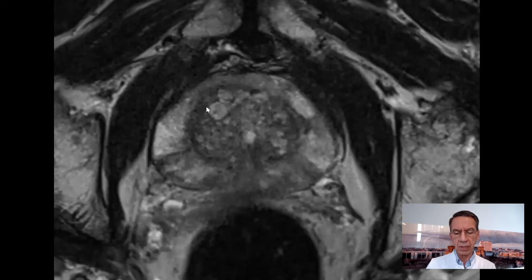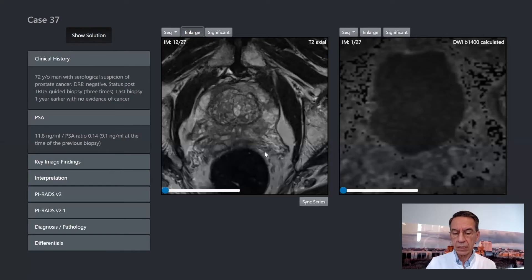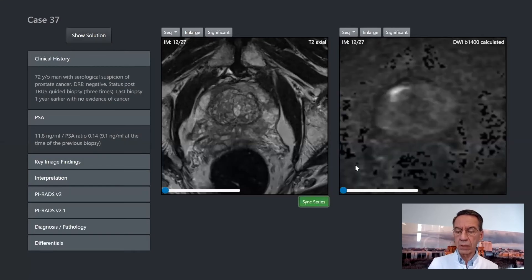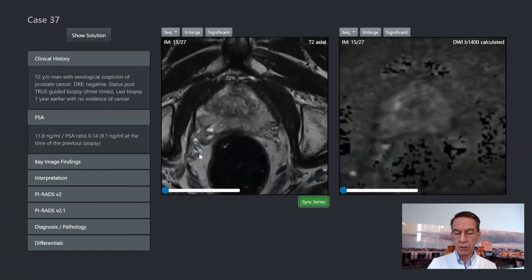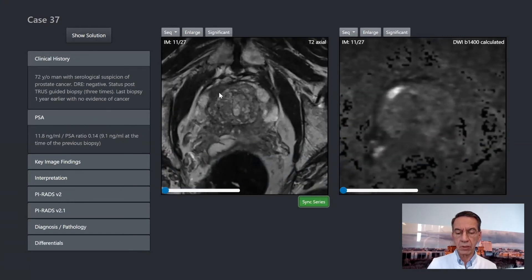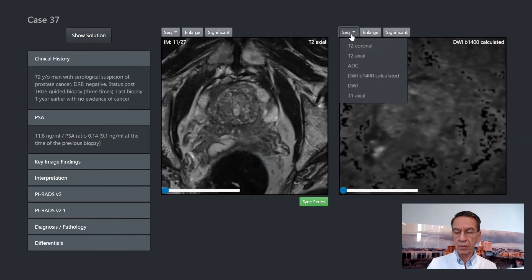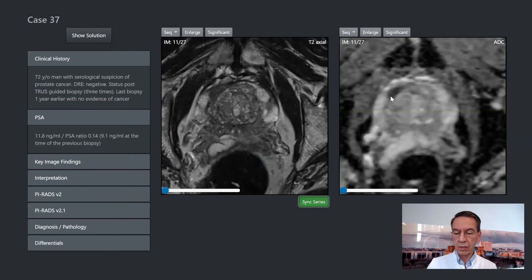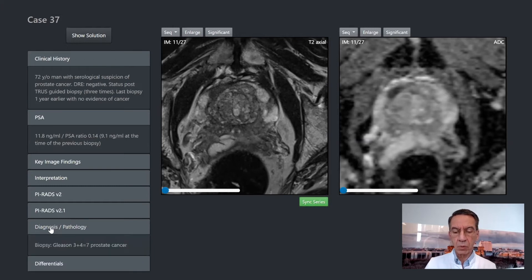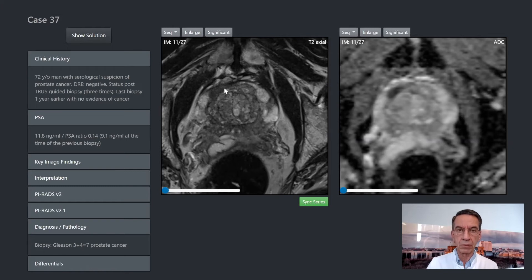That's a little bit difficult to make the decision. Now let's compare this image with the diffusion-weighted image, and here you see a significant diffusion restriction. Looking through the whole prostate, there is no diffusion restriction in other areas, but a significant diffusion restriction of this lesion. The ADC also shows a significant diffusion restriction. Finally, this lesion was biopsied and it was a Gleason 3 plus 4 prostate cancer — very difficult for systematic biopsy because the location is in the ventral part of the prostate.